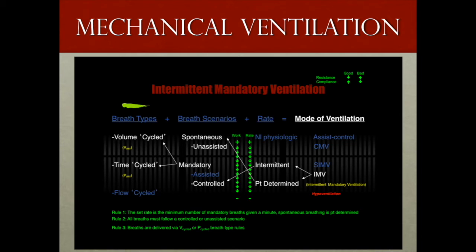The danger in this mode being that if an intermittent rate of 4 breaths per minute or a breath every 15 seconds is set, the possibility of the patient having just finished a spontaneous inspiration and now having a mechanical inspiration laid on top of it can lead to volume or barotrauma, or if the patient is attempting to exhale while the 15-second mark is hit and the ventilator attempts to give a breath, you can have dysynchrony and high pressures for that reason as well.